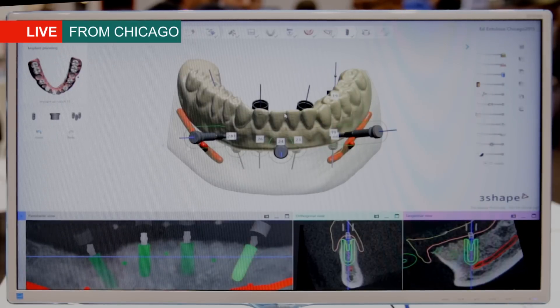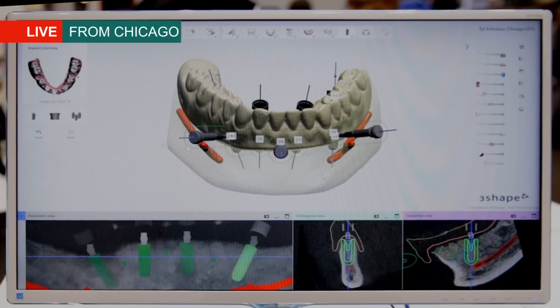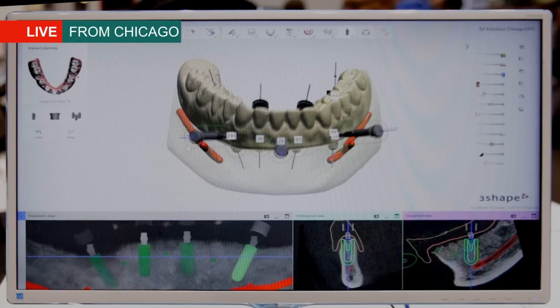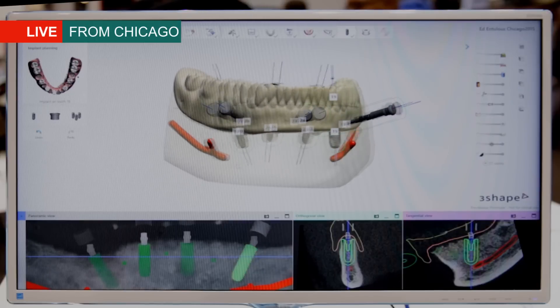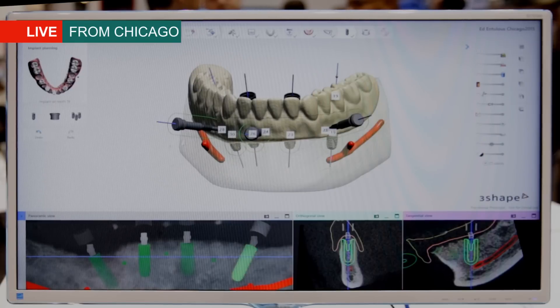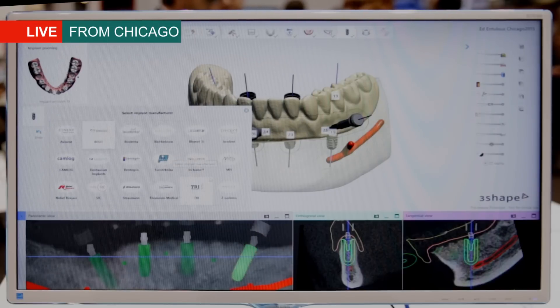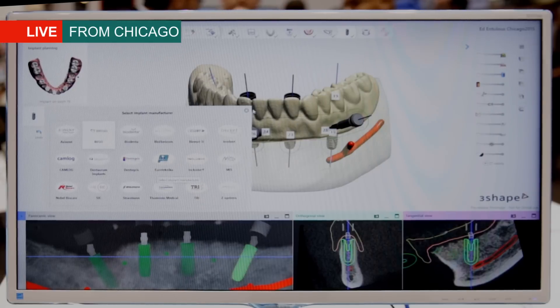A very central step in our workflow is of course the implant planning step. Throughout our application we have really thought efficiency and usability into the design of the software. What we see here is a planned case — we have placed four implants in the patient's mandible, and we also now have anchor pins available. Furthermore, we have expanded our implant library quite a lot with new implant manufacturers, so we're now covering a lot of different manufacturers.